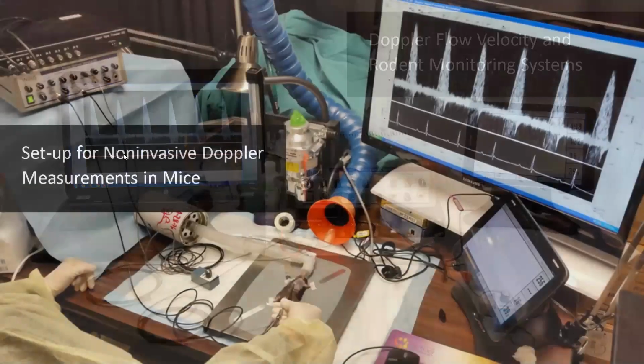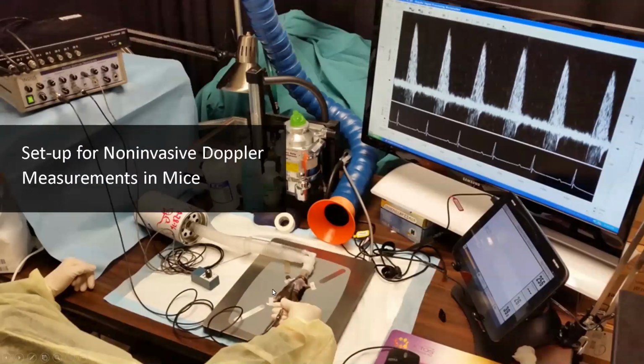Here is the experimental setup for doing that. You have an isoflurane cone, the animal is taped, and you have your probe, and you can adjust your signal depth to where you're listening, and you get a signal on the screen.